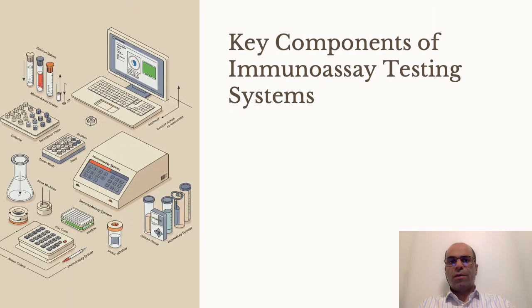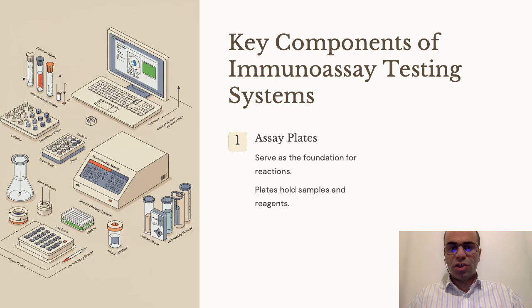Key components of immunoassay testing systems. Modern immunoassay systems consist of three critical components: specialized microplates for sample reactions, automated analyzers for detection and processing, and finally, validated reagent kits containing calibrated materials essential for accurate testing. Okay, let's see each of them in a separate way.